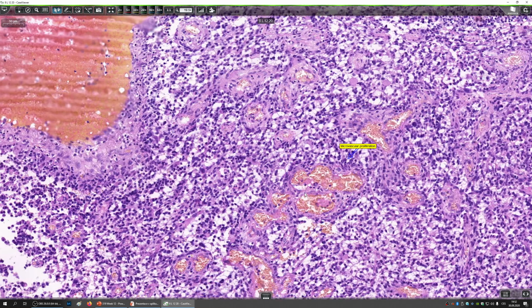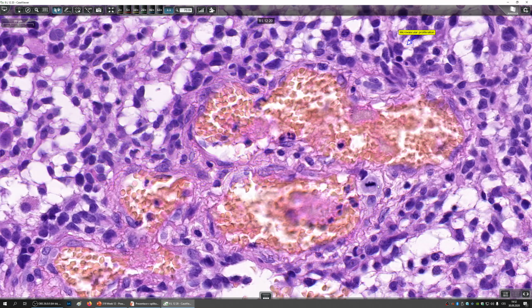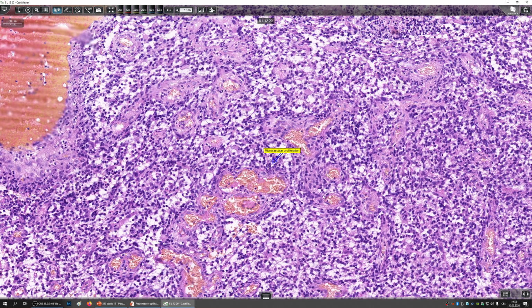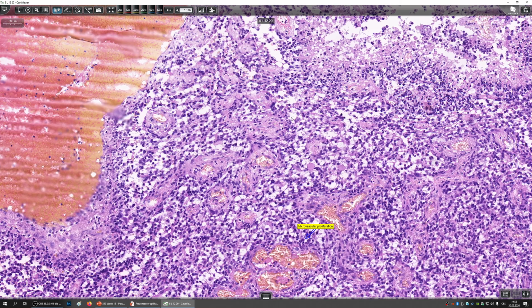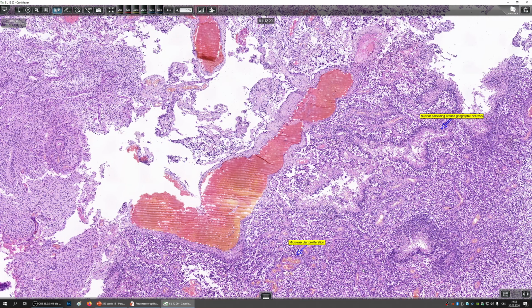This means that in glioblastoma you get newly formed blood vessels in large numbers. Here's a beautiful mitosis. So you get in large numbers newly formed blood vessels. You don't have this in astrocytomas. So newly formed blood vessels in glioblastoma. These are the two trademark features.